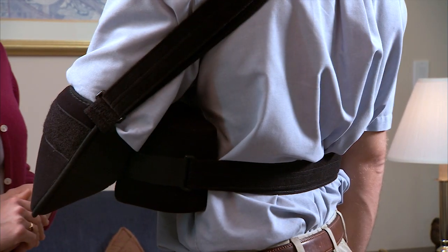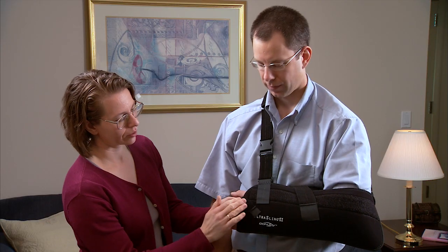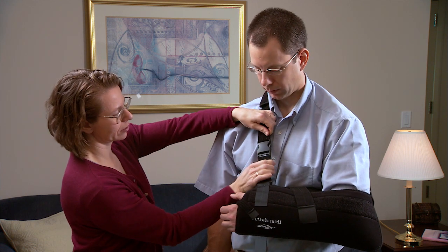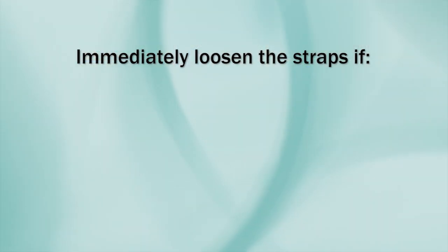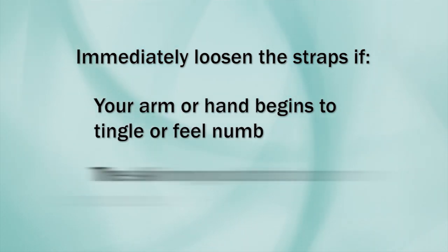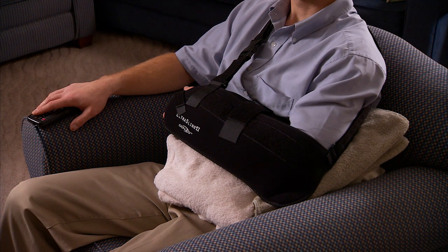Your elbow should be in front of your body and your arm should be bent slightly upwards. Your wrist should be at the midline of your body. Both the shoulder and wrist straps should be snug enough to hold your arm firmly in position. Keep your arm and shoulder relaxed. As you move, the sling might need to be readjusted. Immediately loosen the straps if your arm or hand begins to tingle or feel numb, or if the skin on your hand or arm changes color. It's very important to wear the shoulder abduction sling as long as your surgeon tells you to. Wearing the sling greatly helps with the healing of your shoulder.